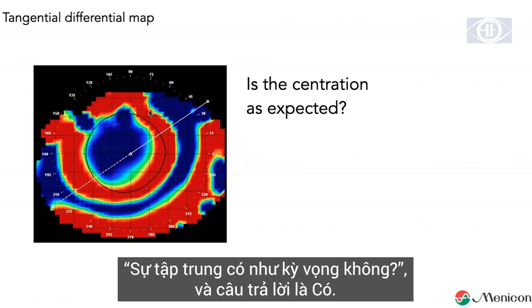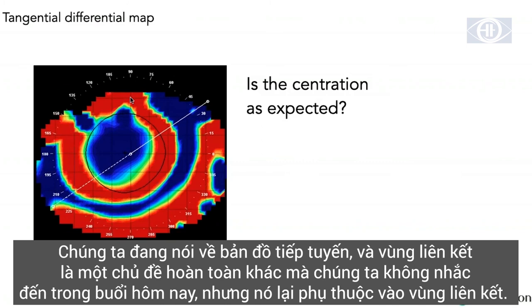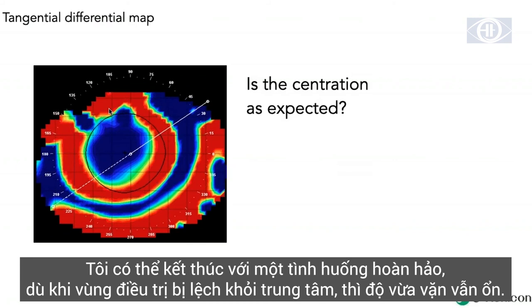In fact, it depends on the alignment zone you choose. We are working with tangents, but that's a totally different topic I don't cover today. You can end up with a perfect centration, even when your treatment zone is a bit off, a bit decentered. The fit of your lens could be very much in the center.